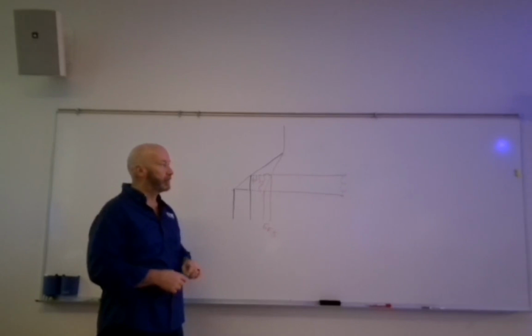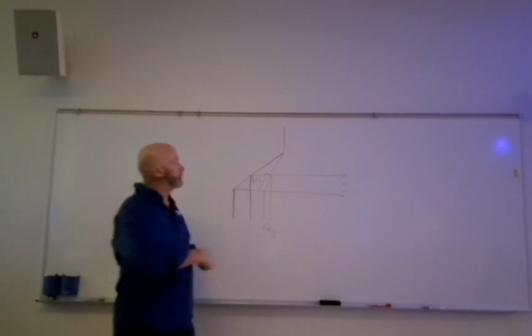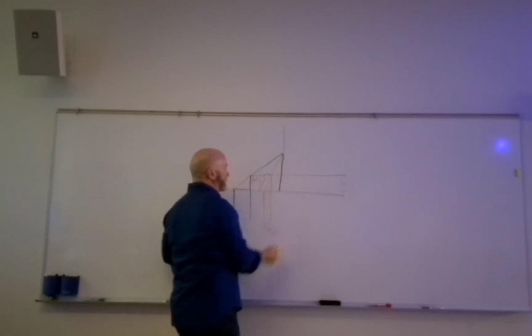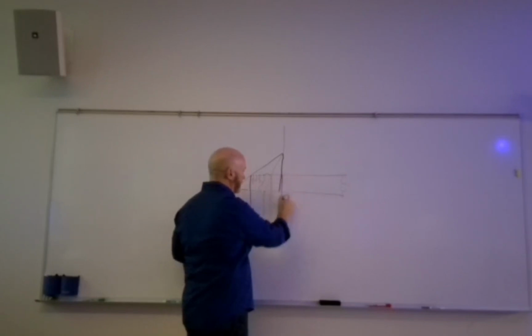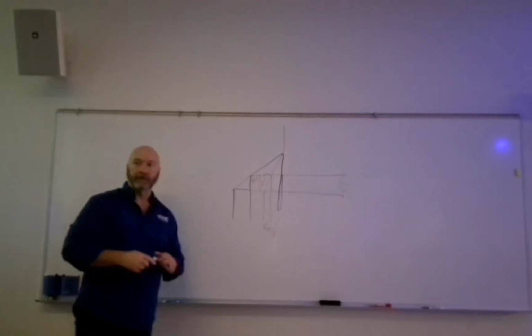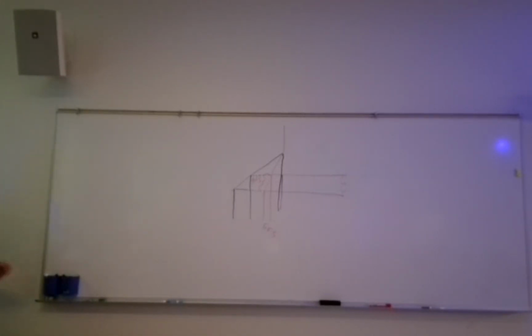How steep is the bevel? The steeper it is, the smaller the number it is. If we make it steeper, then all of that works in the opposite direction. We get a smaller effective focal spot, smaller actual focal spot, and we get a sharper image. Right?